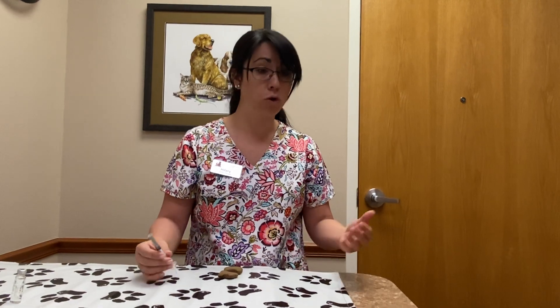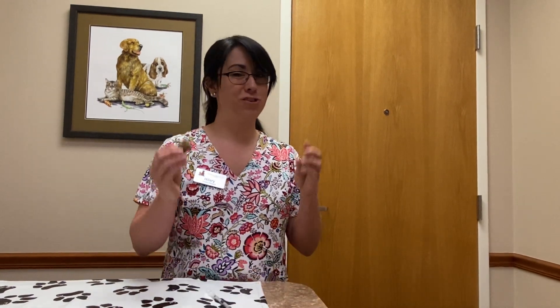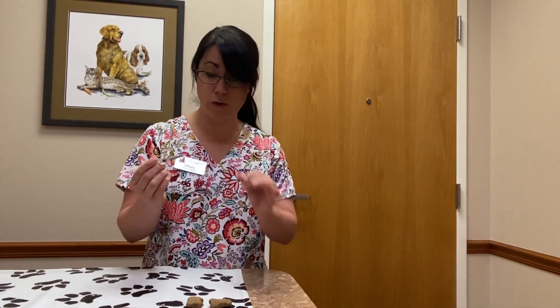Now that we're ready to give an injection, we're going to call our pet over. As discussed in the last video, avoid doing the vaccine right around a major meal. Make sure you have treats ready — particularly approved treats if your dog is on a food trial — and have them ready to go, because we want this to be a positive, rewarding experience for your pet.